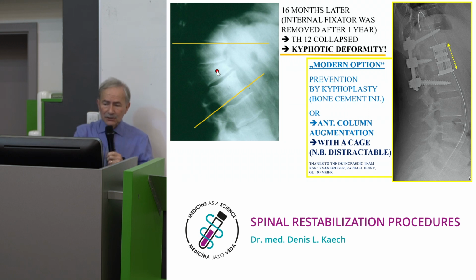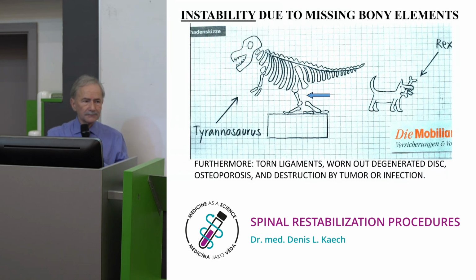Regarding the anterior column, I just make a bracket and say that we have cases with vertebral fractures due to osteoporosis. And when it's an osteoporotic crush, collapse of the vertebral body with pain, then the option to inject cement, do a kyphoplasty by adding a balloon and a stent is a real option for optimal treatment in these cases of painful compression fractures affecting the anterior column. That's the message for you.